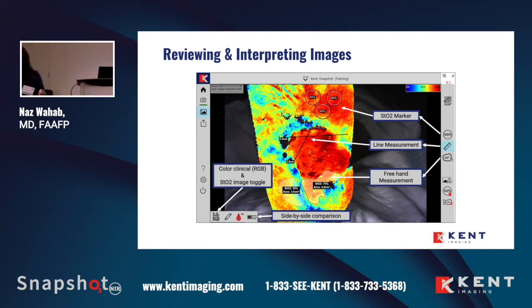Those of you that are doing reconstruction or pre-intervention, I think it's very important that you can also freehand measure certain areas. So for example, if you're doing surgical management, you do need to do some mapping. You need to understand my flap. Does my flap even have where I'm potentially going? Does it have enough oxygenation for that to survive? And I think that these images are very important once you start utilizing them in your practice, that not only can you use it preoperatively for planning, but postoperatively to ensure that your surgical outcome is really, truly what you're looking for.